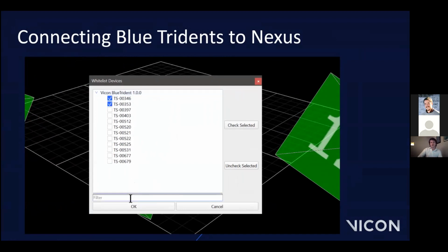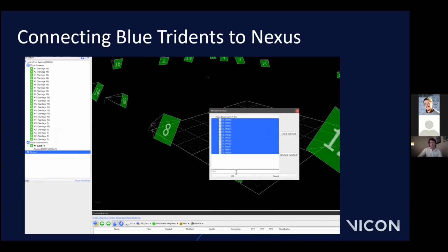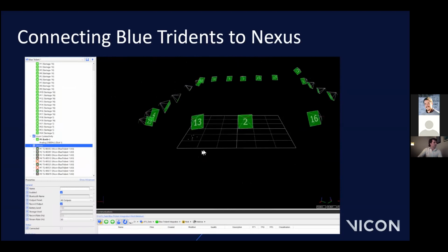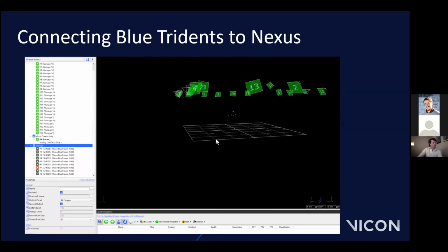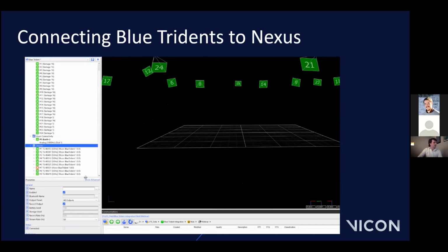So it's always a good idea to make a note of the sensor serial numbers that you'll be using. And you also have the option here just to search for specific sensors, or if you're using all of them, you can highlight them and use the check selected button. So when you click OK, this then brings the sensors into your system tree. And it takes a moment or two just for them to all get picked up by the Bluetooth and to connect. Once they all go green, it means that they are connected and streaming data.